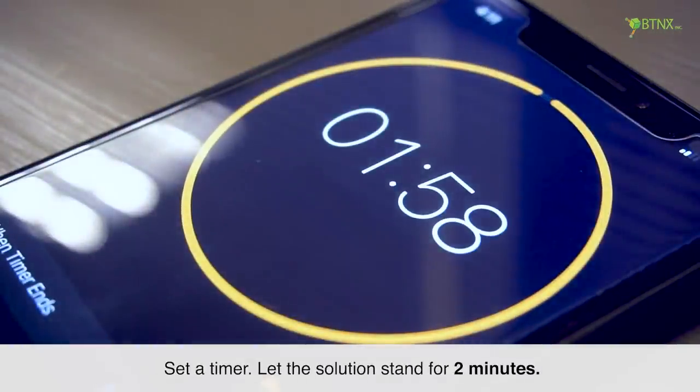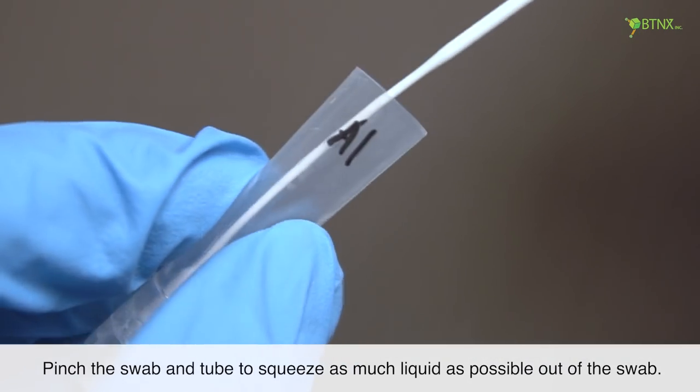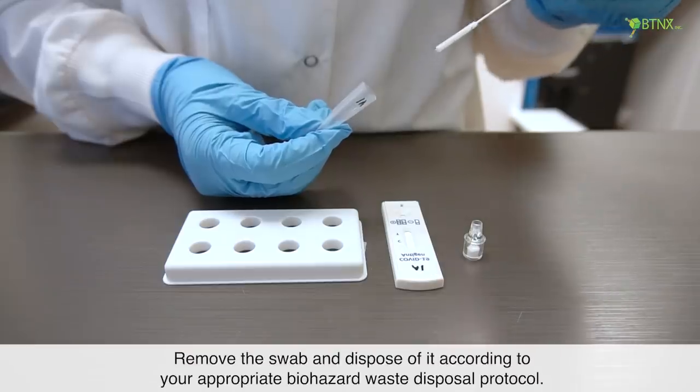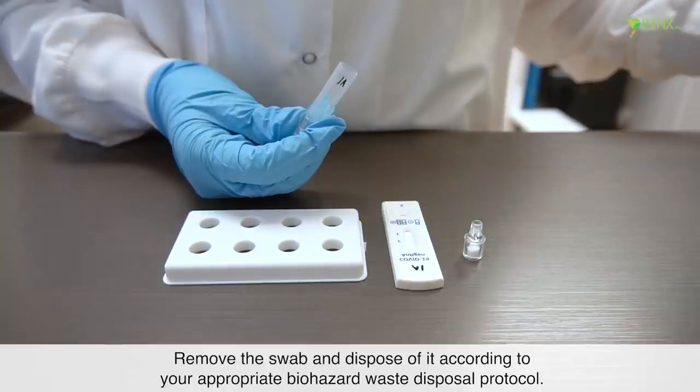Set a timer and let the solution stand for 2 minutes. Pinch the swab in the tube to squeeze as much liquid as possible out of the swab. Remove the swab and dispose of it according to your appropriate biohazard waste disposal protocol.